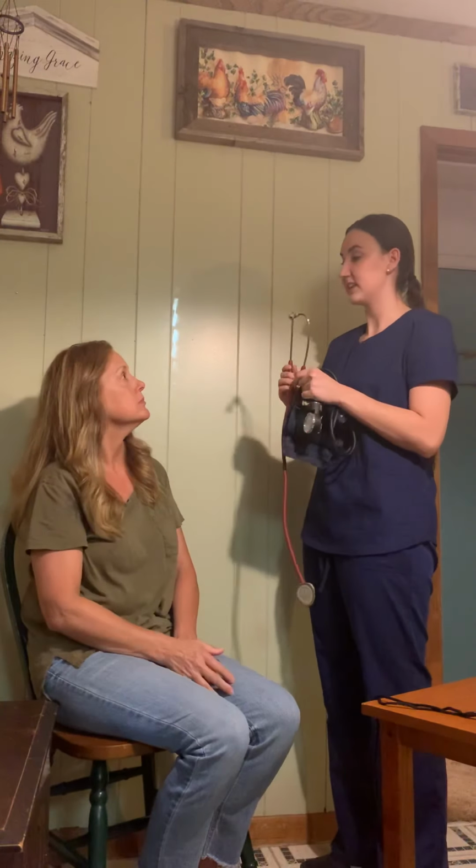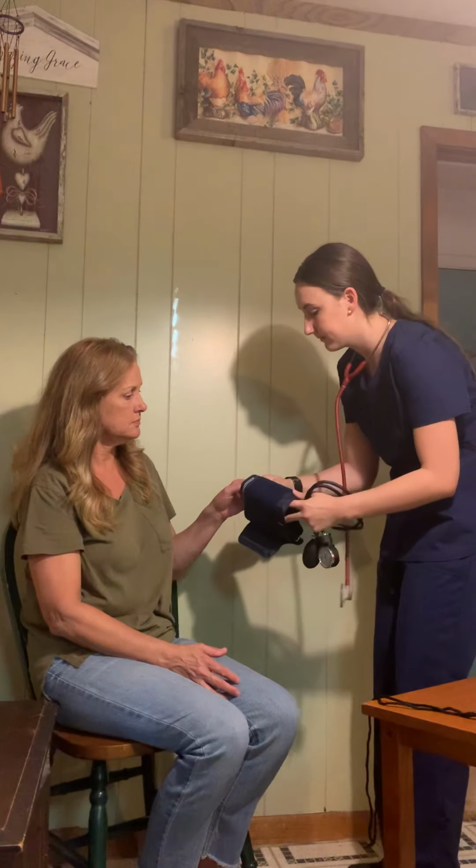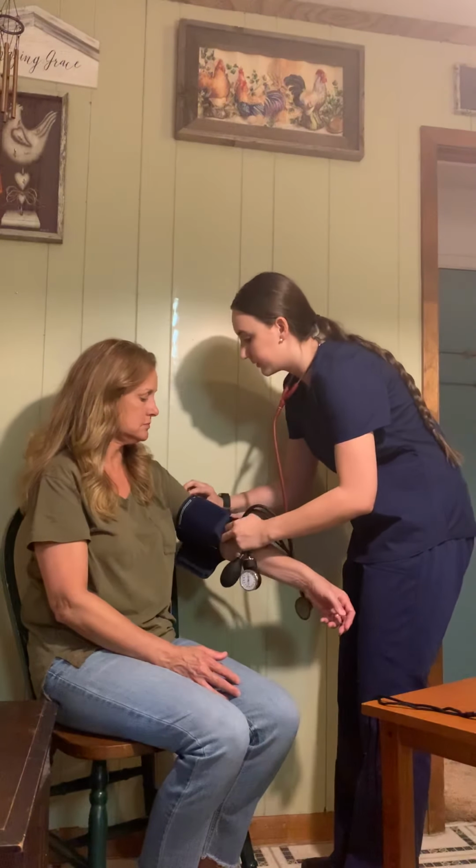Next is your blood pressure. So I'm going to put on a blood pressure cuff. I'm going to pump it up. It'll help take your blood pressure, and then there's a dial that I'm going to read. And I'm also going to listen to your heart with a stethoscope. So I'm going to slide this on your arm. I'm going to roll your sleeve up.